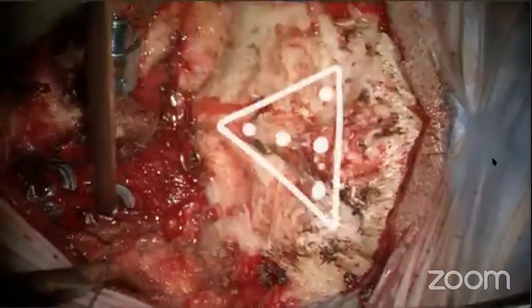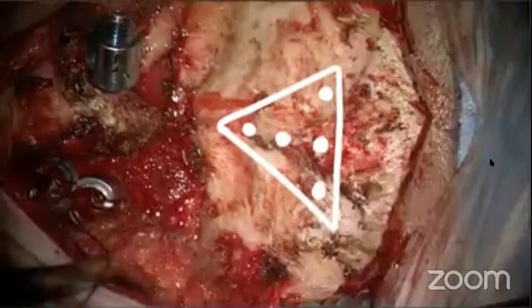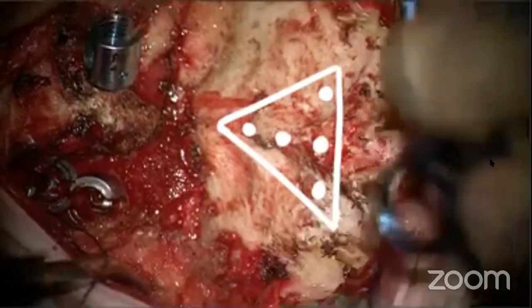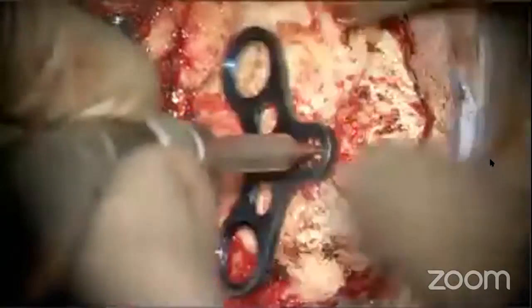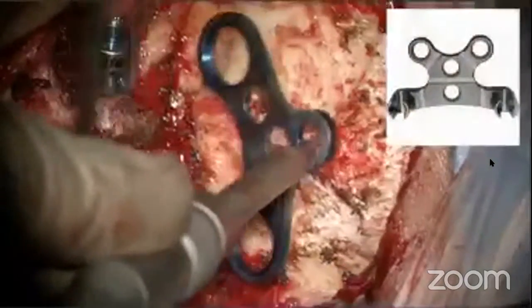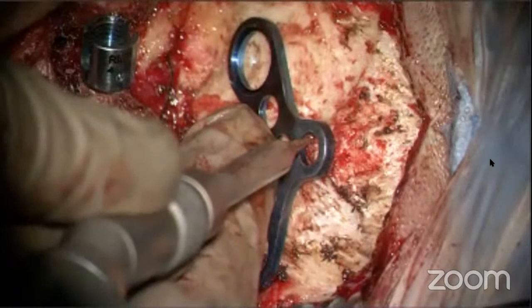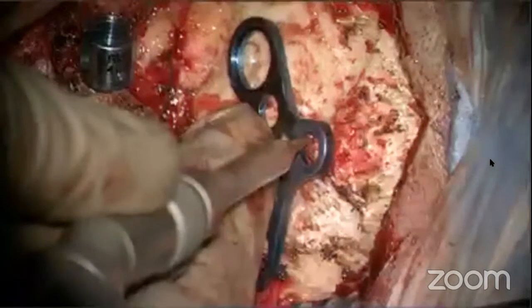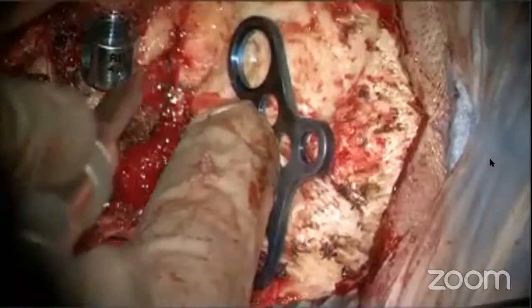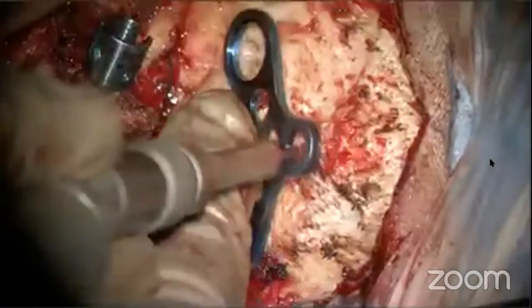Ideally, the screws should be in an area that corresponds to this inverted triangle shown here, whose base is just below the EOP. This midline keel plate does not allow the screws in an inverted triangle configuration, but there are ones available like this that can. We cannot place this plate in reverse, as by doing that, the side connectors will be prominent underneath the scalp. Make sure that the size of the plate is appropriate such that the rod will connect easily to the cervical screws.